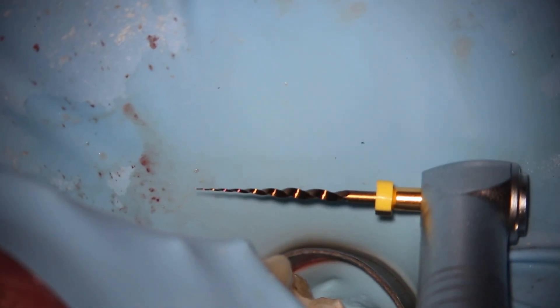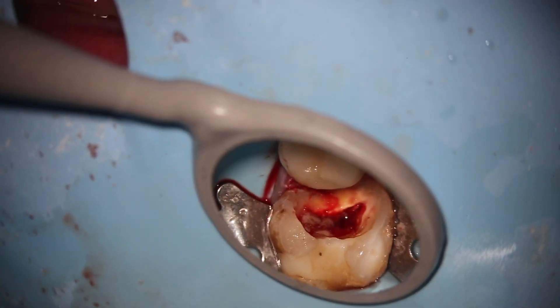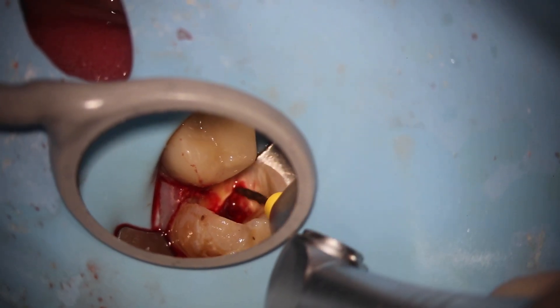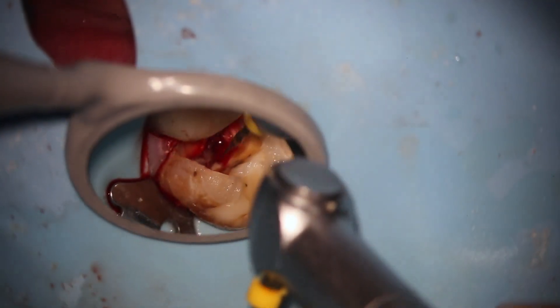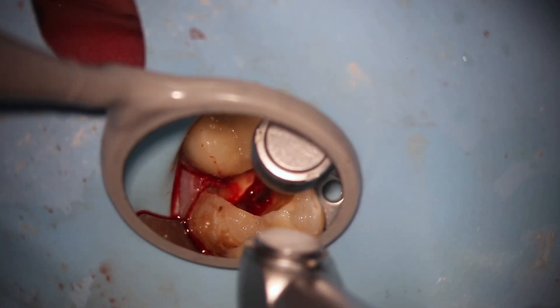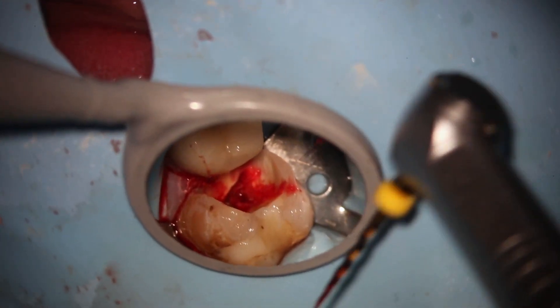Now comes the coronal flare with the ProTaper Gold SX — 300 RPMs, four to five brushes to the outer wall, only going in the coronal third, as deep as the 10c went down. I'm brushing to the outer wall — the mesial buccal wall, whatever the name of the canal is, that's the outer wall. This is the DB, so I'm brushing to the DB wall four to five brushes, and your coronal flare is done.